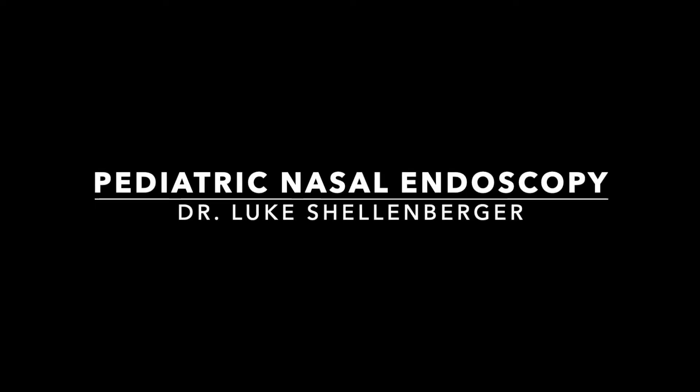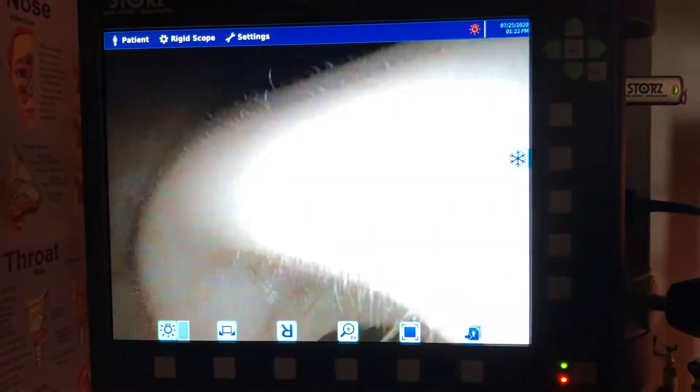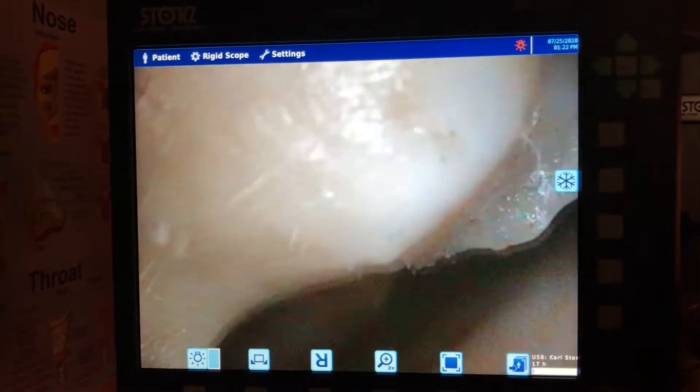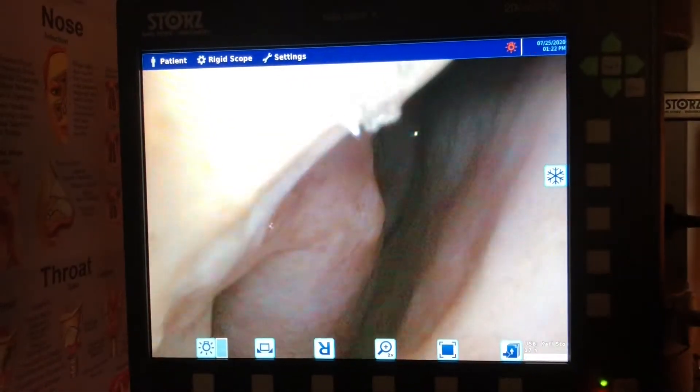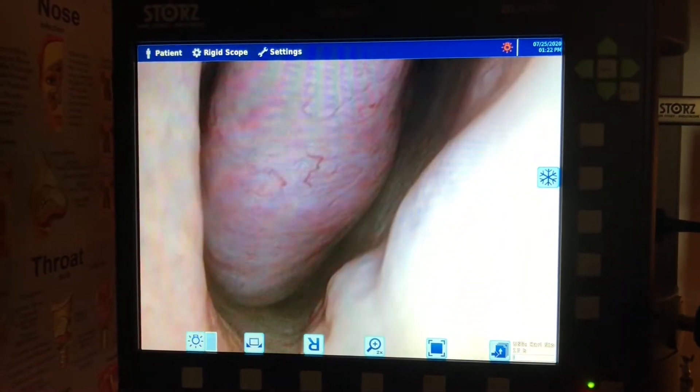My name is Luke Schellenberger. I'm an ENT doc. We're going to show you what the inside of a nose and the back of the nose — the nasopharynx — looks like. This is actually on a pediatric patient. Lawson is only 10 years old.